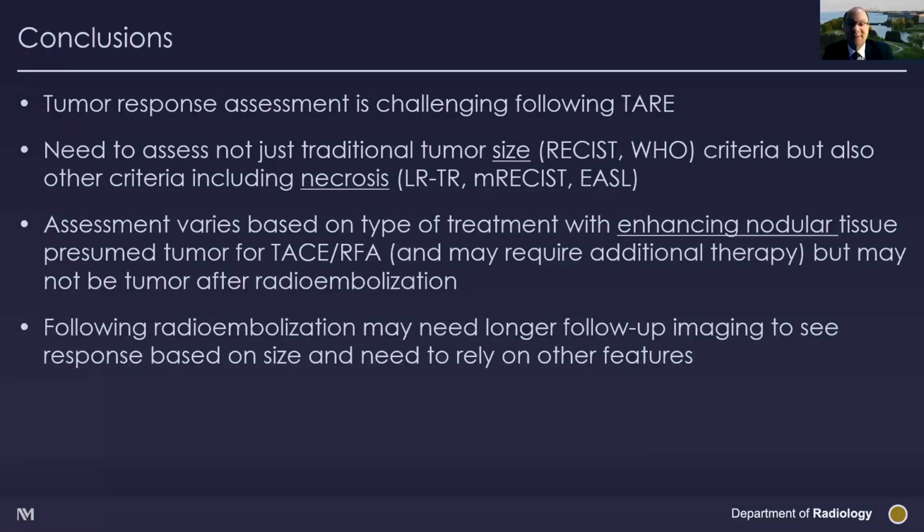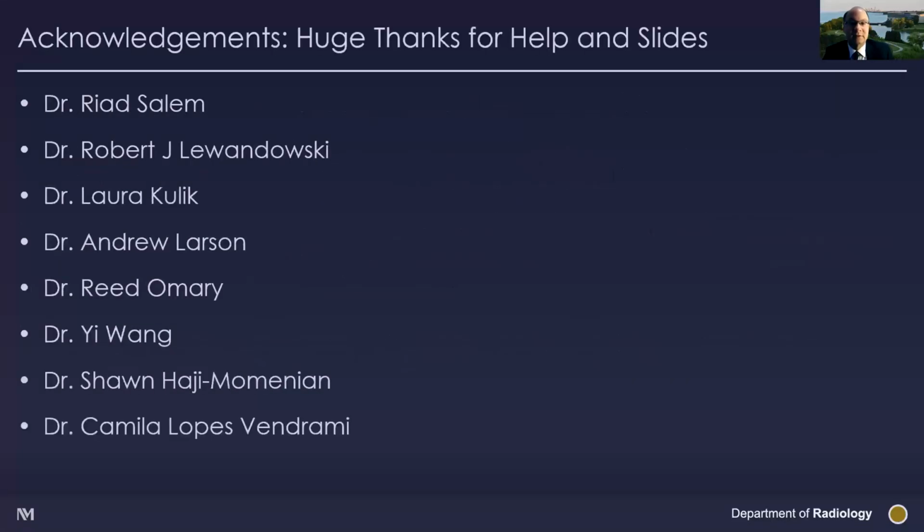And following radioembolization, you certainly need, as I hopefully emphasized, longer follow-up imaging to see a response based on size, and you need to rely on other features. And a lot of times I do give them the benefit of the doubt because I do know how effective the therapy is. I'd certainly like to thank the pioneers in this technique, as Ziv had mentioned, Riyad Salem and Bob Lewandowski, and we've got a ton of people who are well-trained, and certainly thank the other people as listed on this slide as well.